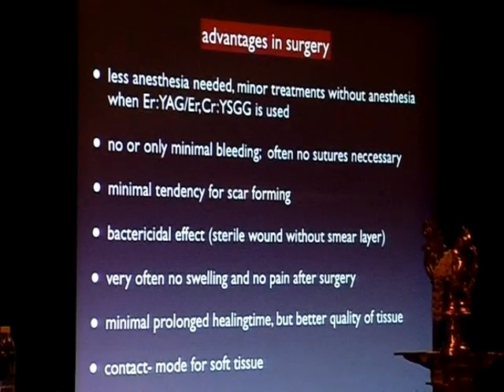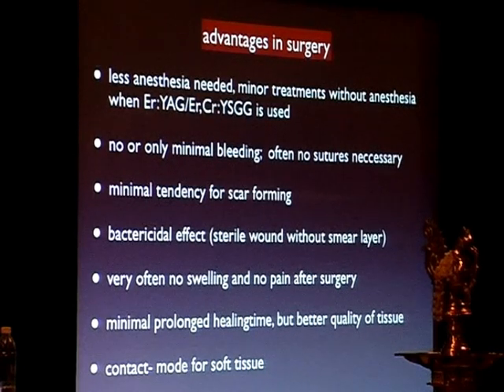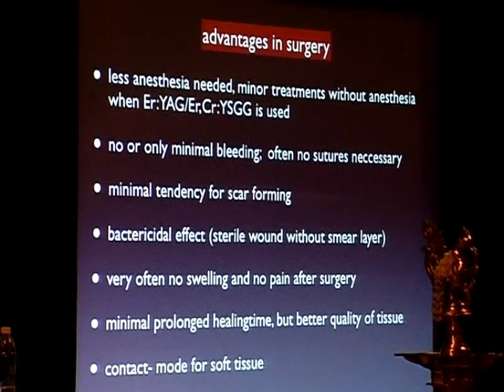If you use the erbium laser for small procedures, you even need no anesthesia. But with diode lasers, I would always recommend anesthesia. You have no or only minimal bleeding, so minimal bleeding with erbium YAG and no bleeding with diode lasers, and often there are no sutures necessary. There is a minimal tendency of scar forming. You have a bactericidal effect, and very often no swelling and no pain after surgery. That's why we use lasers in surgery. You have a minimally prolonged healing time, but the quality of the tissue is much better. And if you use both lasers in surgery, you always use contact mode.